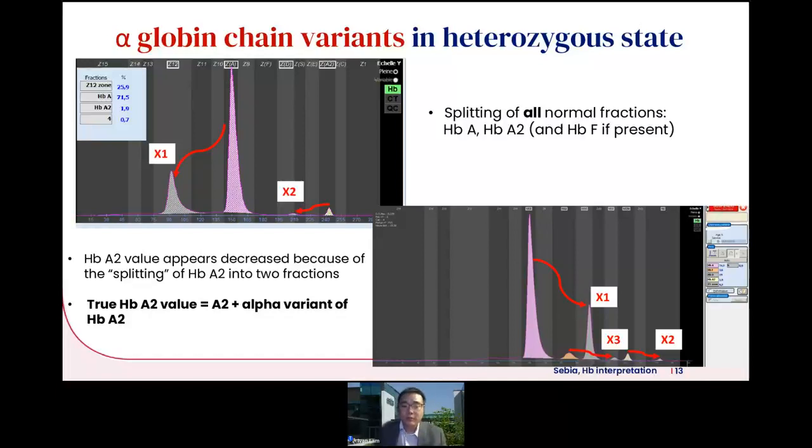So whenever you want to make a diagnosis of alpha globin chain variants, this equidistant shifting and splitting would be something that's very signature to alpha globin chain variants. So reminder again, remember that the true hemoglobin A2 value is always the combination of the normal hemoglobin A2 and whatever is the variant, be it an alpha chain or be it a delta chain.